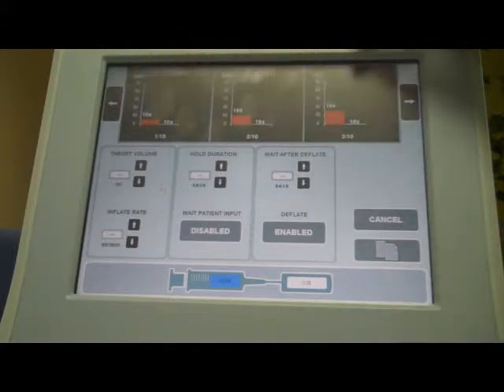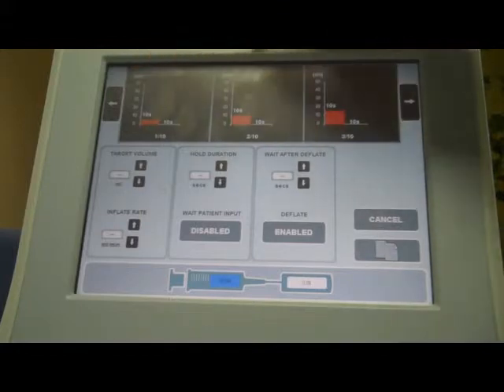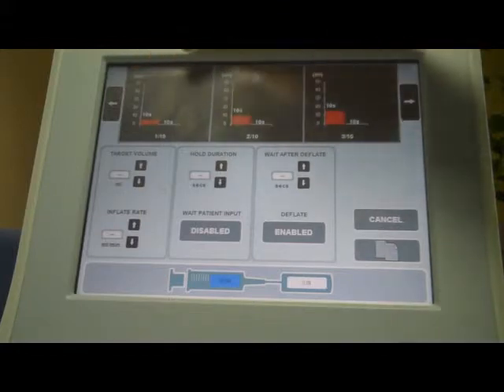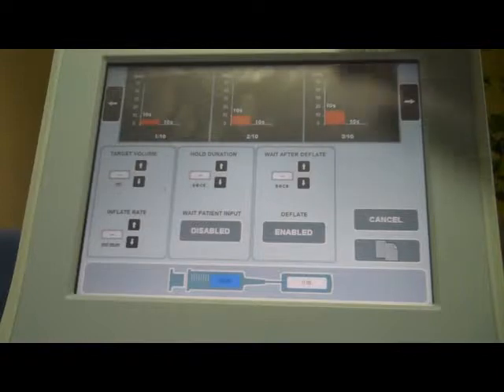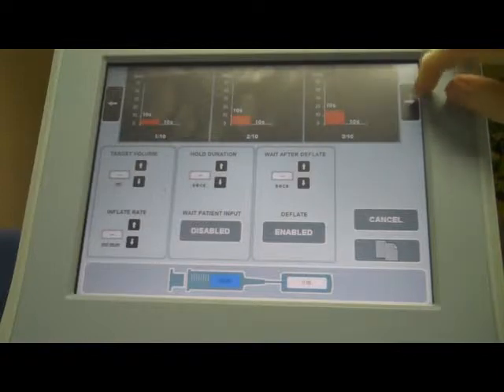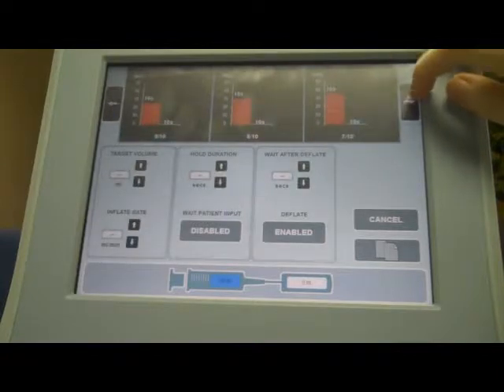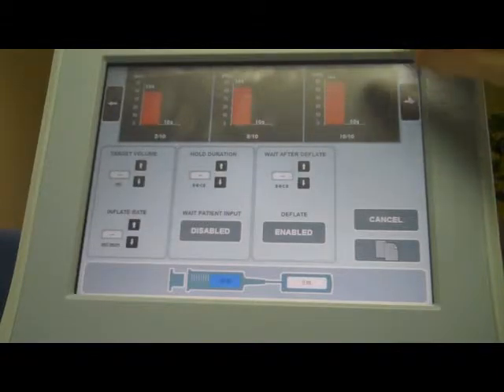On the screen at the top, you'll see three graphs. Each of these graphs represents a step. There are up to ten steps, and you can scroll through each step by pressing the arrow buttons.